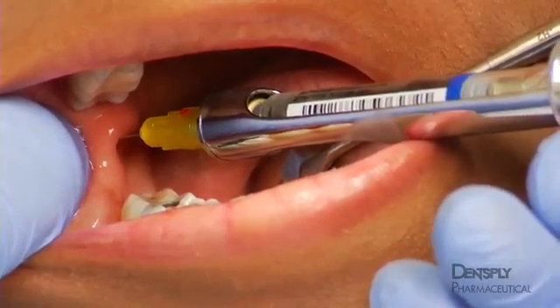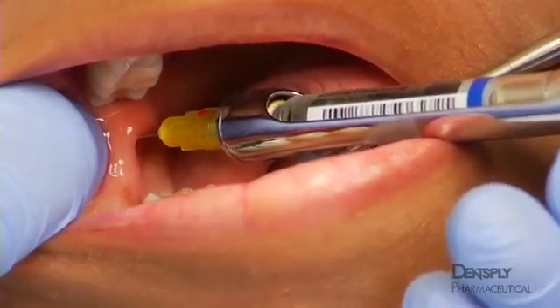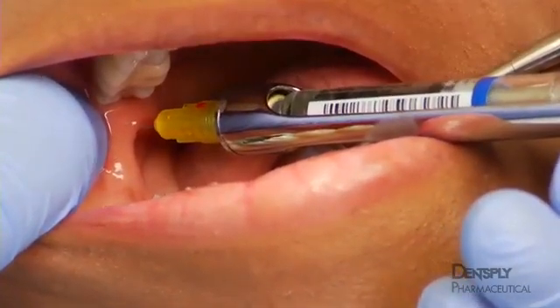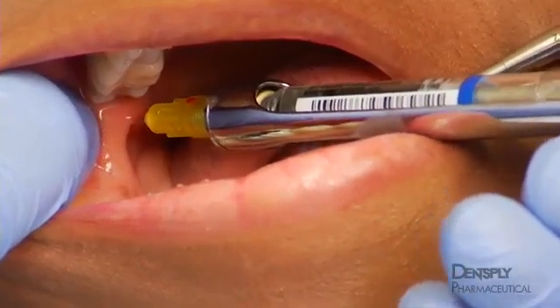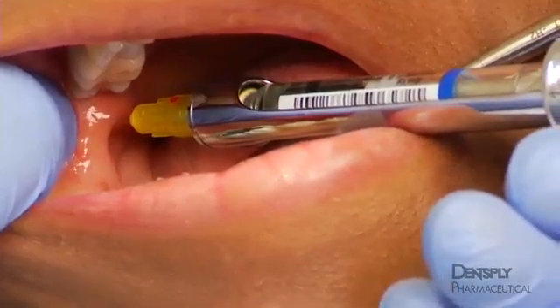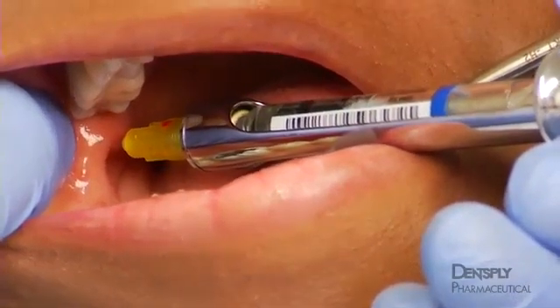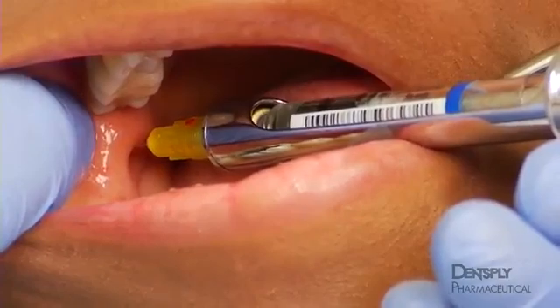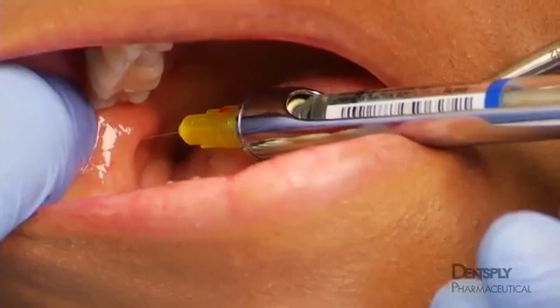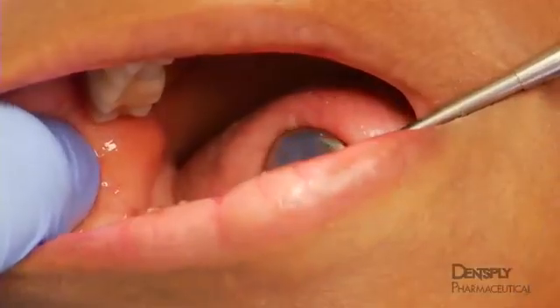Once bone is contacted after an insertion of 2 to 2.5 centimeters, the needle is withdrawn slightly and an aspiration test is performed. After a negative aspiration, approximately 2/3 of the cartridge is injected at a rate not to exceed 1 cartridge per minute. If lingual nerve anesthesia is desired, it can be easily achieved by withdrawing the needle halfway and depositing the remaining third of the cartridge after a second negative aspiration test. The needle is then removed and the patient is allowed to rest for the 3 to 5 minutes it normally takes for anesthesia to develop.